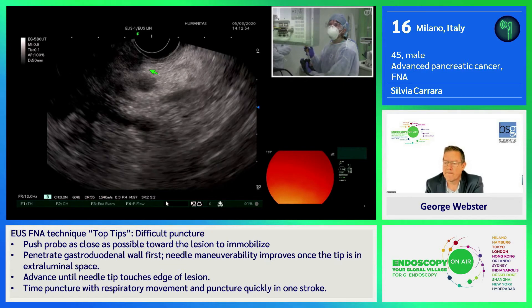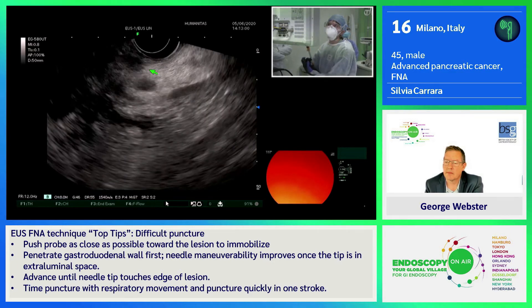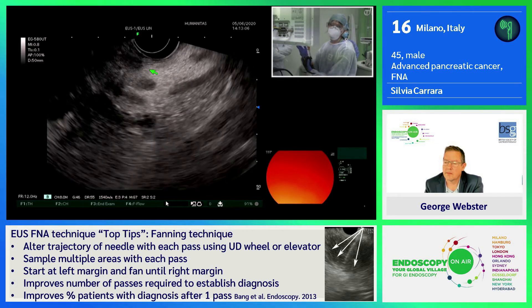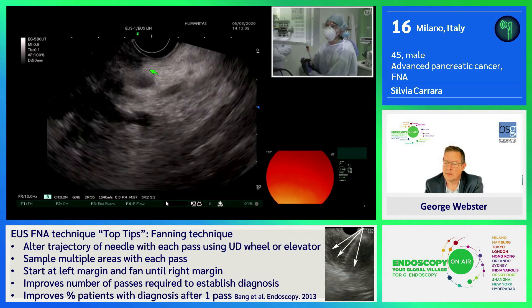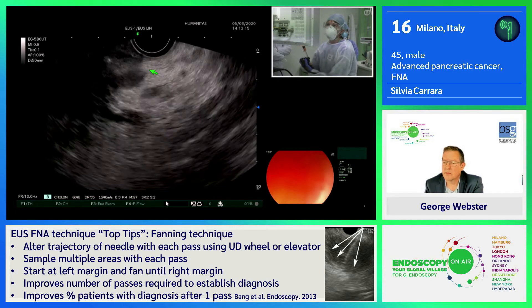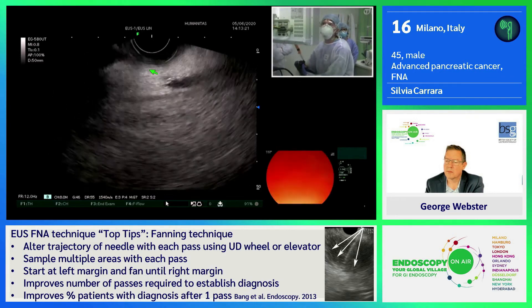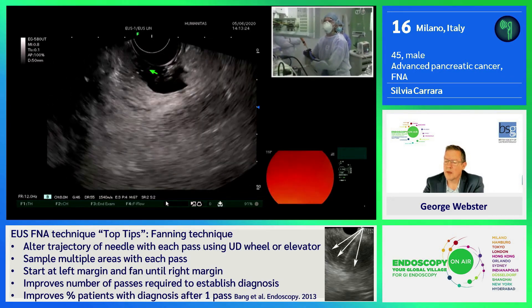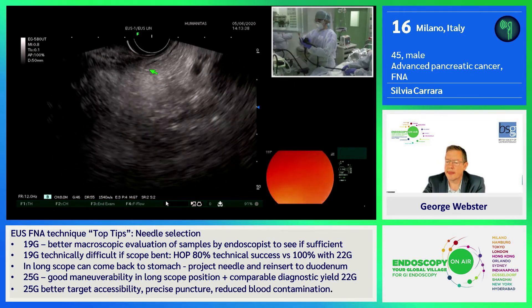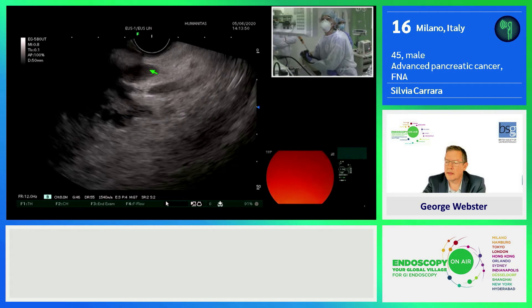I chose an FNB needle because we have very good results with this needle, and we can also send the samples to the pathologist for histological diagnosis. Since I'm in the uncinate process, the 25 gauge needle is one of my favorites. With this very flexible instrument, you can also use a 22 gauge needle if you prefer. The Medtronic SharpCore needle has a platform that allows you to choose the needle size, and we start with this 25 gauge needle.